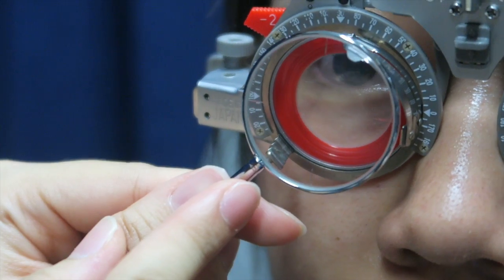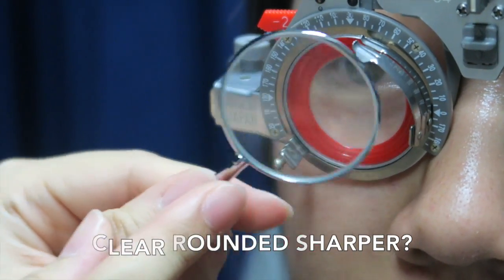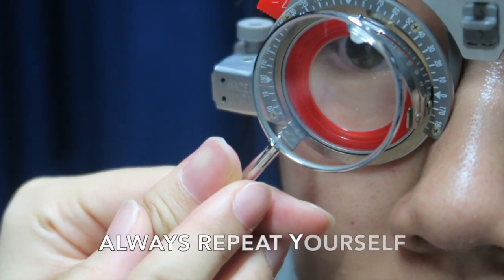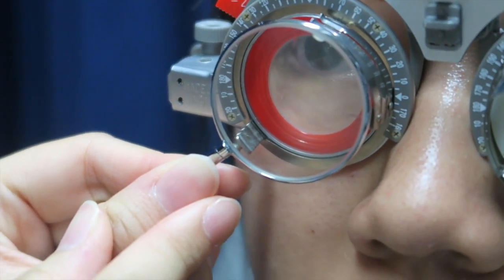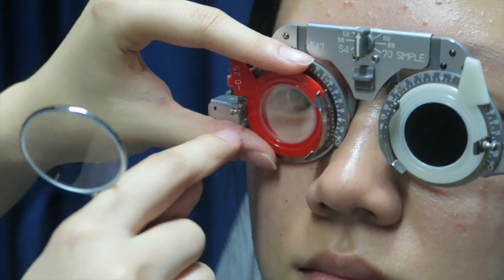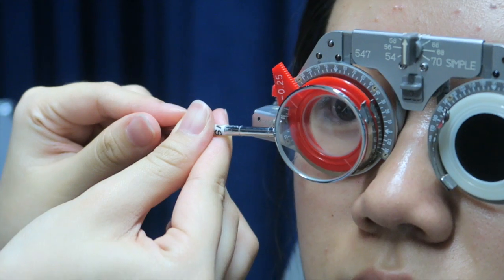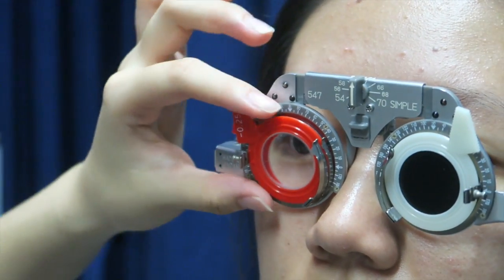The endpoint is when the patient says both lenses look the same. Ask: 'Is lens one making the dots clearer, rounder, darker and sharper, or lens two?' Always repeat yourself. Remember to align the JCC handle to the cylinder lens axis and repeat your instructions until the patient says both lenses look the same.